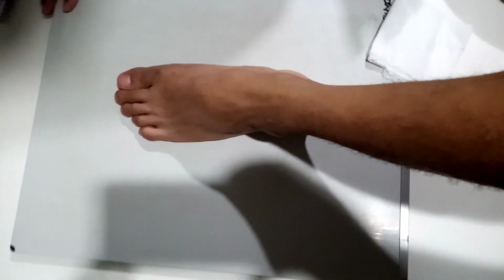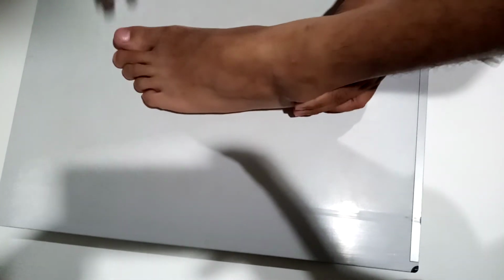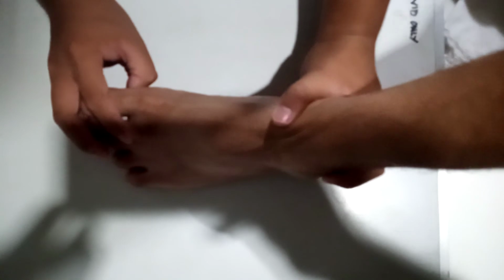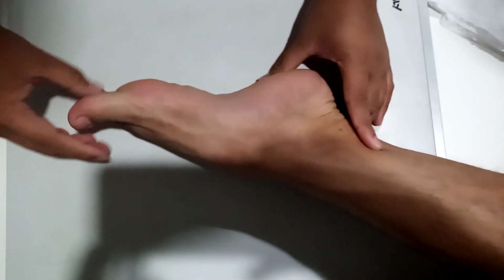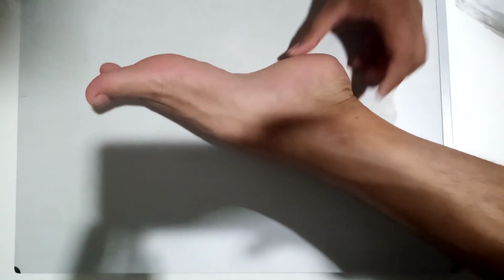Place support under the affected knee and leg as needed to place the plantar surface of the foot perpendicular to the IR. Center the IR to the mid-area of the foot, and adjust it so that the long axis is parallel with the long axis of the foot. The foot must be dorsiflexed and form a 90-degree angle with the lower leg. That is medial rotation. Make sure that the foot is centered on the image receptor.